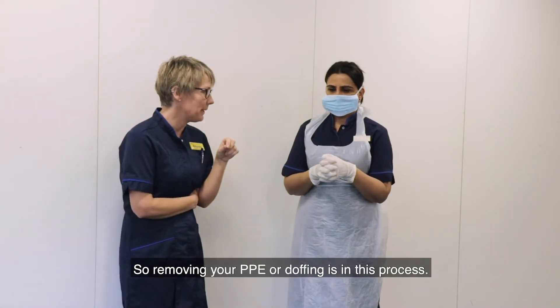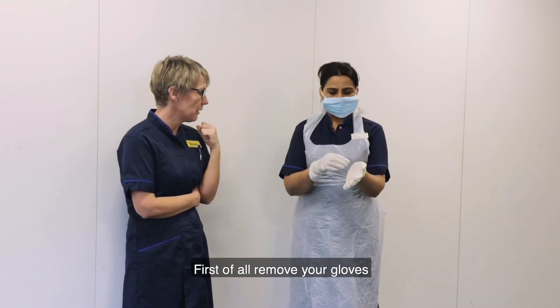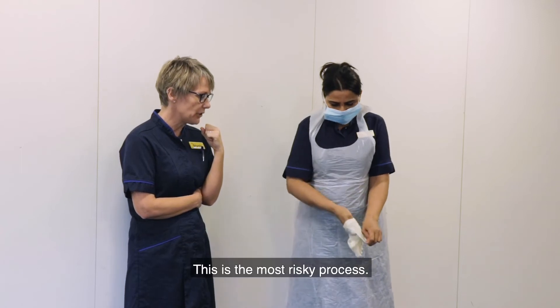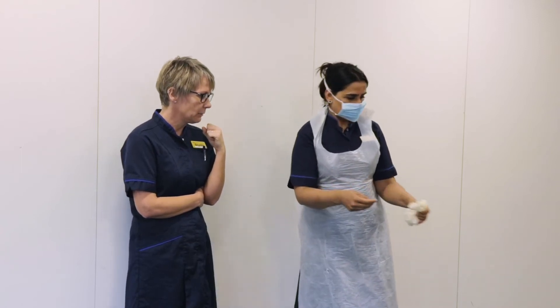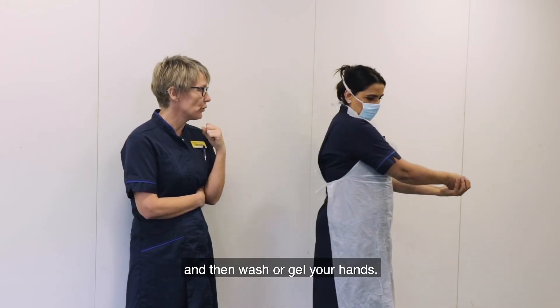Removing your PPE, or doffing, follows this process. First of all, remove your gloves, making sure that you don't touch the outside of them, as this is the most risky process. Dispose of them in clinical waste and then wash or gel your hands.